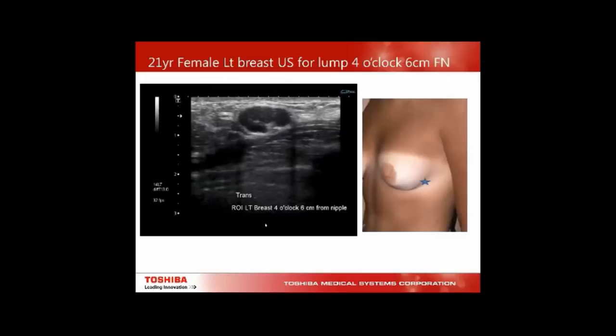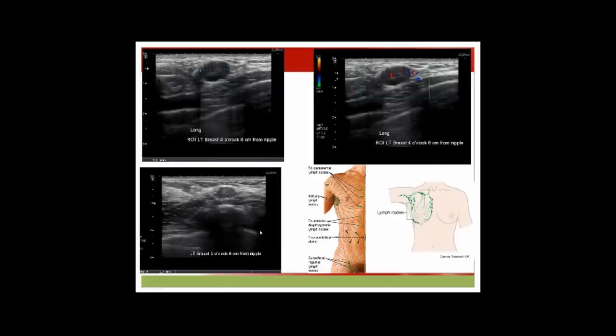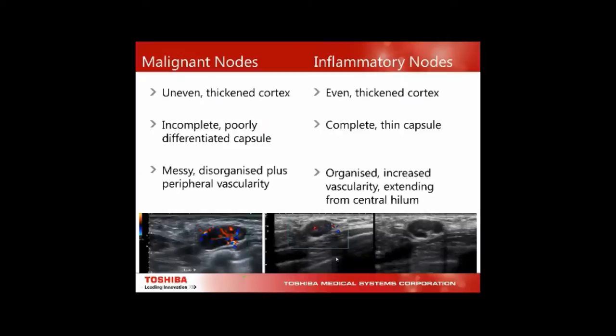Don't forget the normal inflammatory node. This 21-year-old female came with a lump at 4 o'clock that was identified just outside the breast as a lymph node; going further up, there was a whole group of them. This girl had an infected belly ring — which drains to the outer axillary area as well as the groin. Beware: it may be an inflammatory node from an infected belly ring.